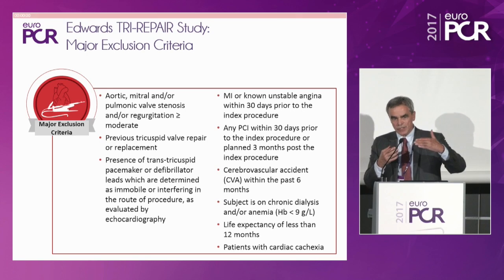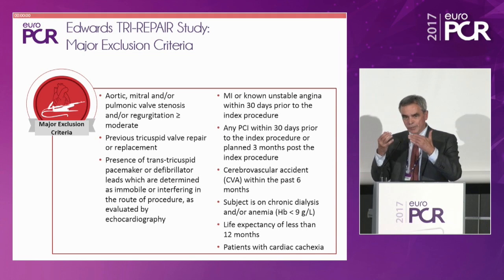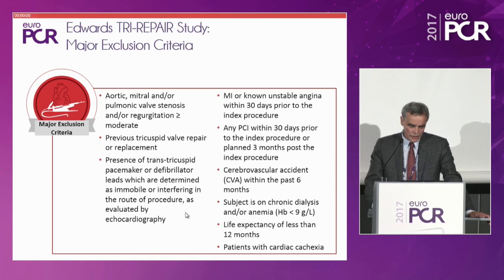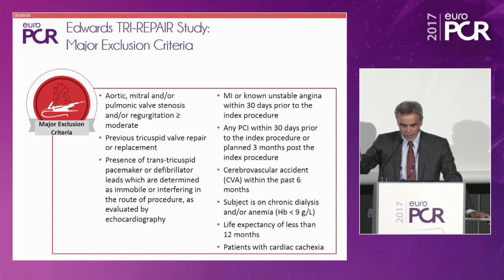And you know that sometimes these leads move into the commissures. And then, of course, you take the risk that you would fix that lead somewhere. So we want to make sure that we are not interfering with the lead. That's the critical issue. It's not the lead itself, it's the location of the lead that needs to be taken into consideration. It's very much like what we do also on the mitral. You want to be on the septal side of any lead that is in the right atrium if you go across the septum. So you don't want to take that lead inside of your transcatheter procedure.